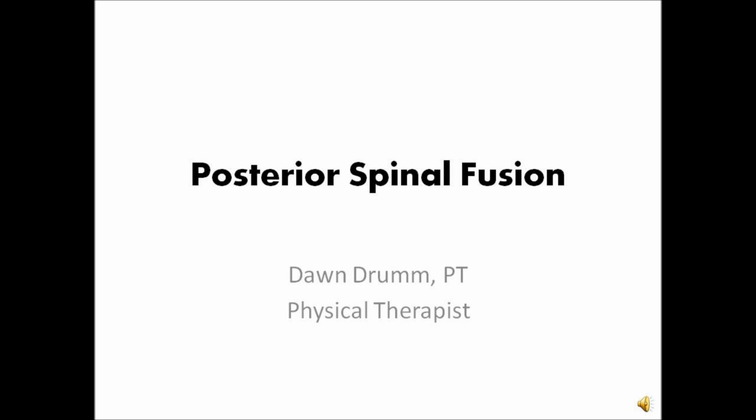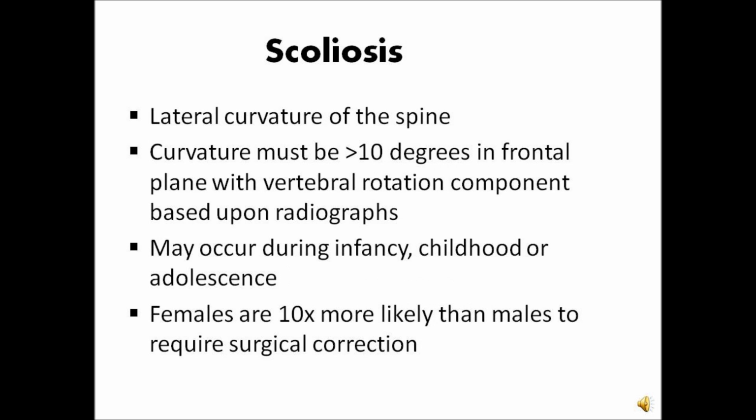The surgical procedure I am going to discuss today is a posterior spinal fusion. I am going to present some background information first on scoliosis, since this is the main reason a child would undergo a spinal fusion.